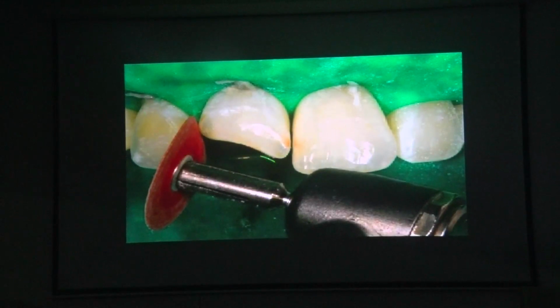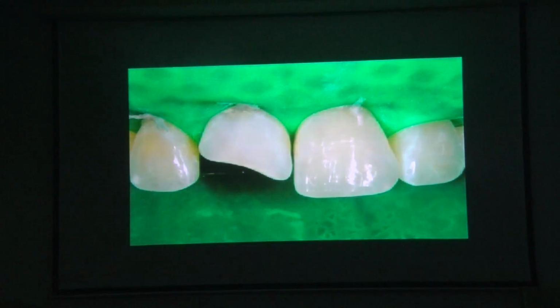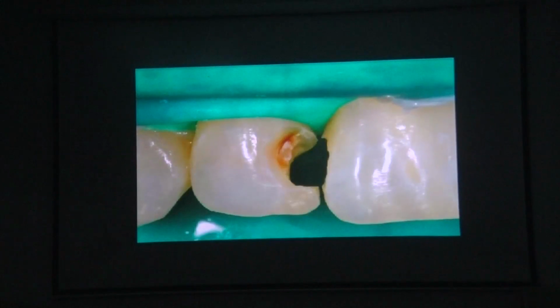Also the edges. See now I cannot perceive the straight line. You see the curved line now? That's very important. I over etch it slightly. Now I get a beautiful blend.